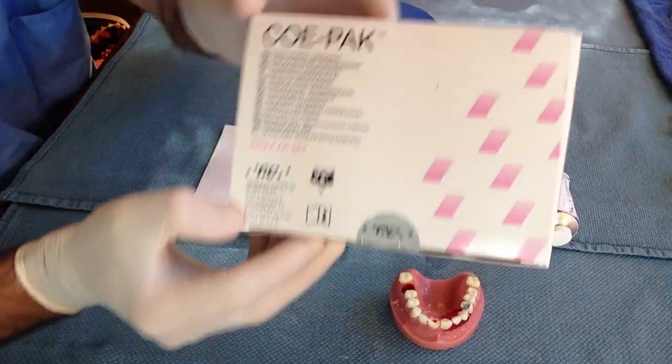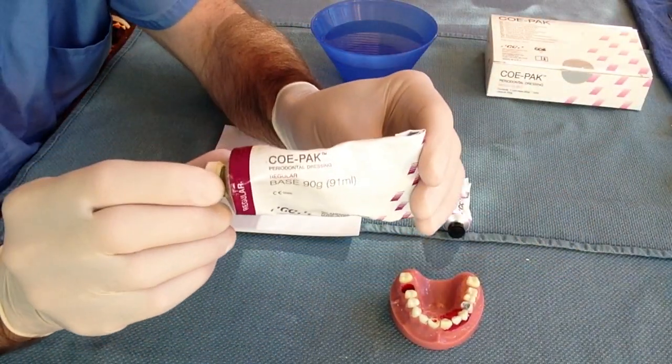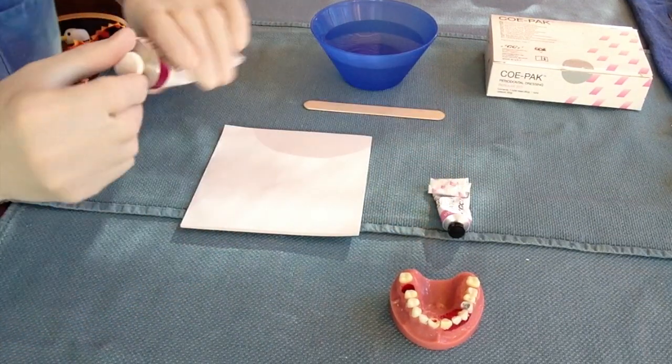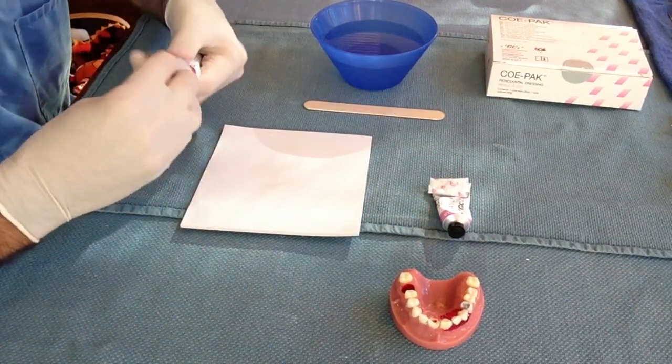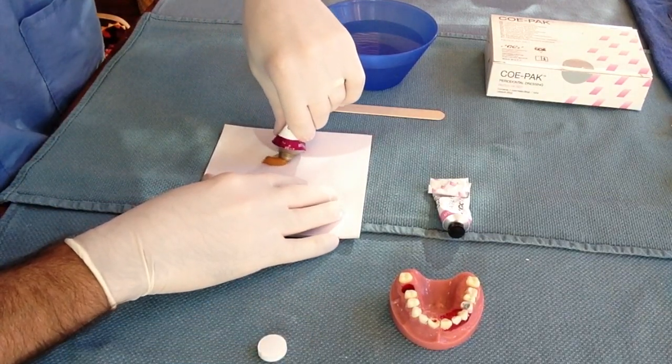The dental box contains Copac, which is periodontal paste. It works very well to stabilize loosened teeth in a variety of different situations. It also works very well in the treatment of gingival lacerations, often making suturing unnecessary.